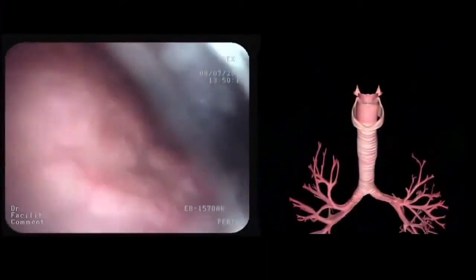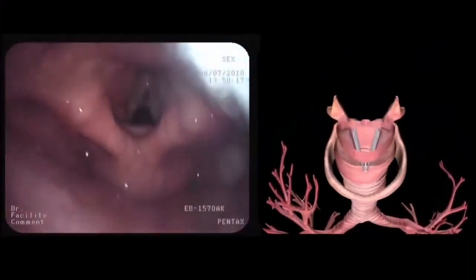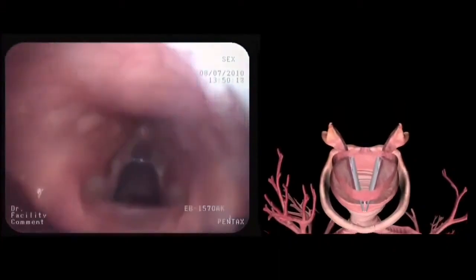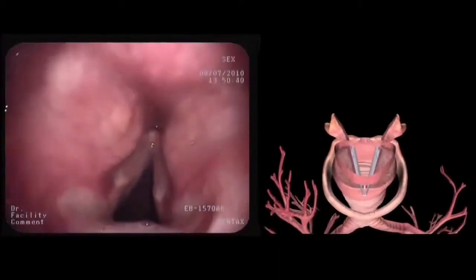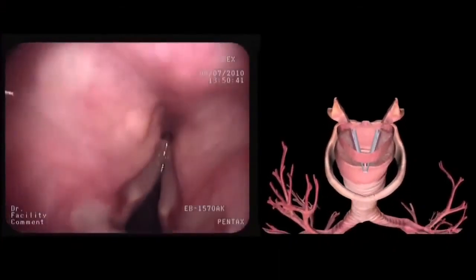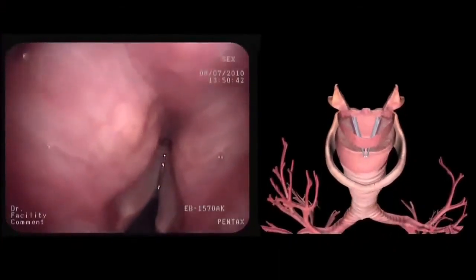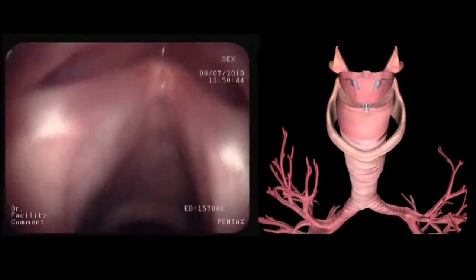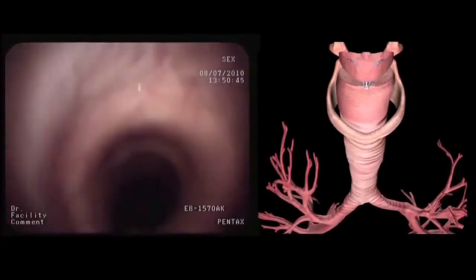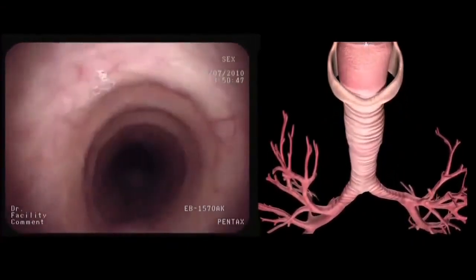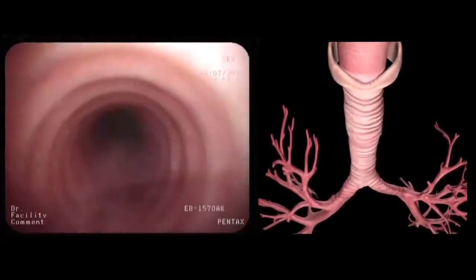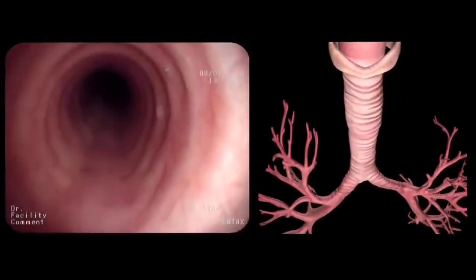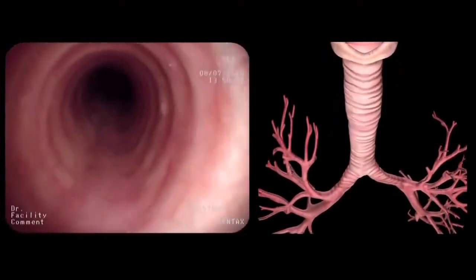After passage through the nose, the pharynx, and the epiglottis, the glottis is reached. After inspection of the vocal cords and arytenoids, the bronchoscope is advanced into the trachea. While staying in the middle of the airway lumen, the trachea is carefully inspected.